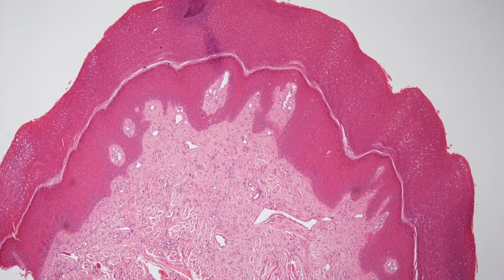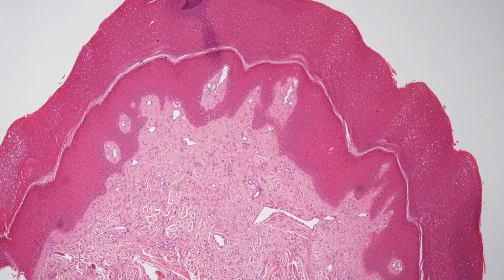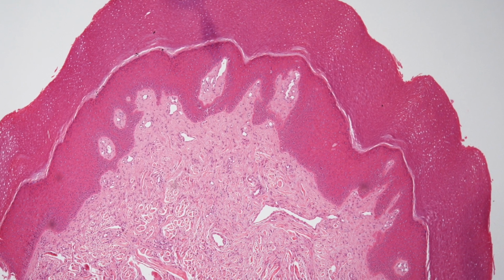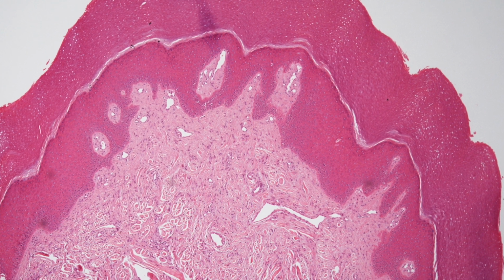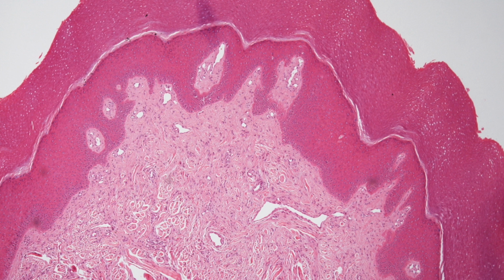Here is a low power view of an acquired digital fibrokeratoma. It is clearly hyperkeratotic. The underlying epidermis is also acanthotic, and you can also see that the rete ridges are indeed in areas branching.